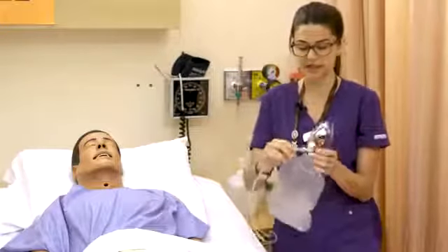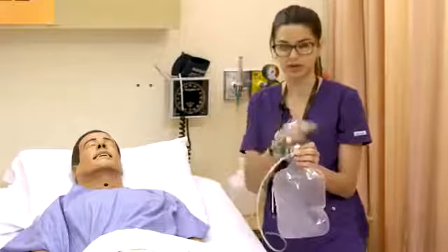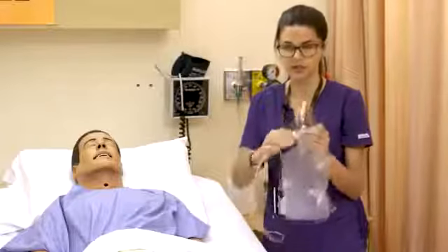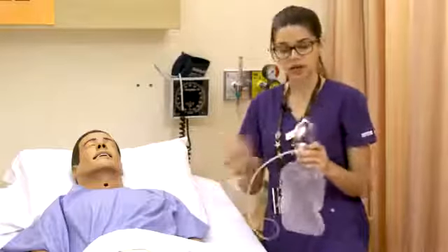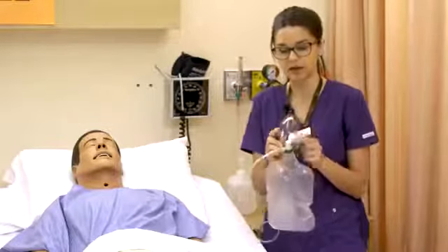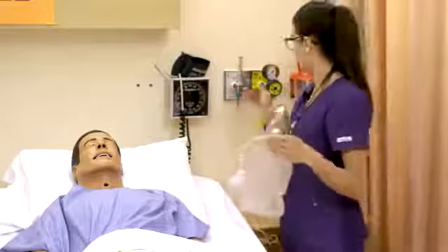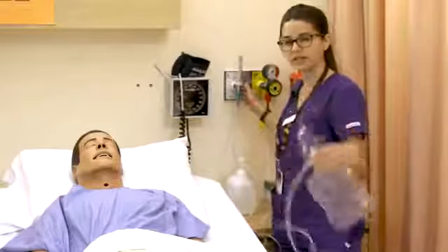How this mask actually used to work was it had one of these one-way valves on both sides, so that created a dangerous situation for the patient, as you can probably imagine. If somehow the oxygen came unhooked, the person could actually suffocate because they're not getting any room air. So they've changed it to this modified version for safety reasons, really. This modified non-rebreather can be 8 to 15 liters.